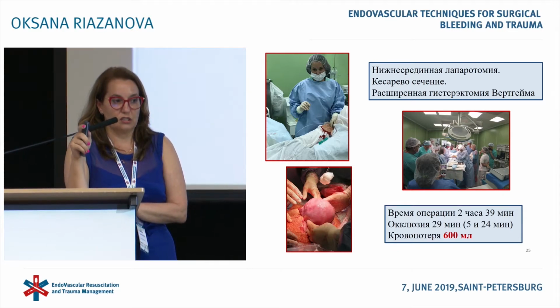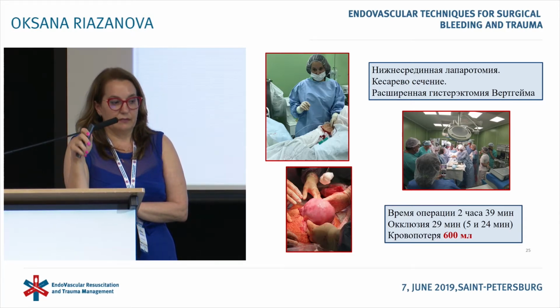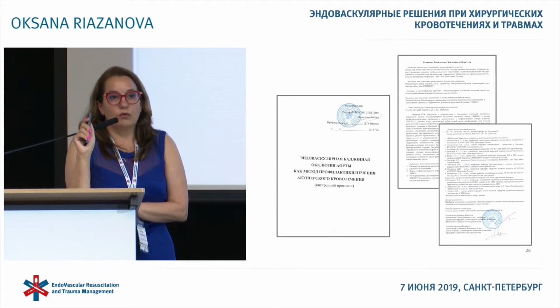Time of occlusion: it happened twice that we did occlusion, 29 minutes in total. First, we inflated the balloon when we were extracting the fetus, and then during the bloodiest part of the surgery, in coordination with oncosurgeons. The blood loss was 600 milliliters.